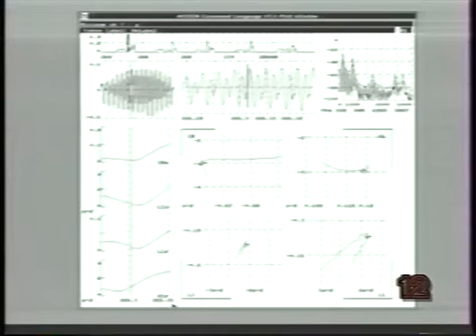Next, the labeled acoustic events are used to guide algorithmic data extraction. The signals on the lower left are velocity magnitude versus time for the 4 transducers. On the lower right are expanded XY trajectories. First, mid-vowel spectra of the acoustic signal are displayed with algorithmically picked LPC peaks. Then, the cursor and crosshairs move automatically to the time of the minimum velocity for each transducer, for extraction of X and Y coordinates. At each step, the experimenter checks the operation of the algorithm.